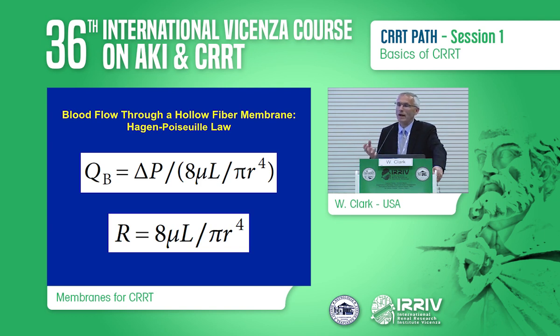But basically, the fundamental relationship for blood, when it behaves according to laminar flow and as a Newtonian fluid, is that the blood flow rate is a function of the so-called end-to-end pressure drop, in other words, the arterial to venous pressure drop, divided by the resistance to flow. Very basic concept. And in fact, if you break down the denominator of that equation and isolate the resistance, you can see it is a direct function of fluid viscosity.